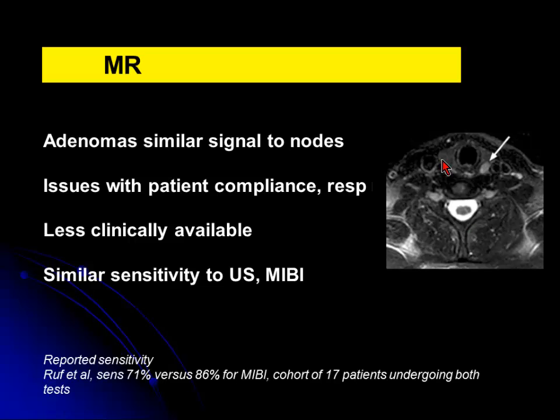So this is the T2 fat sat. This is the thyroid, and this shows a posteromedial nodule with a high signal, confirming that it is a parathyroid adenoma.